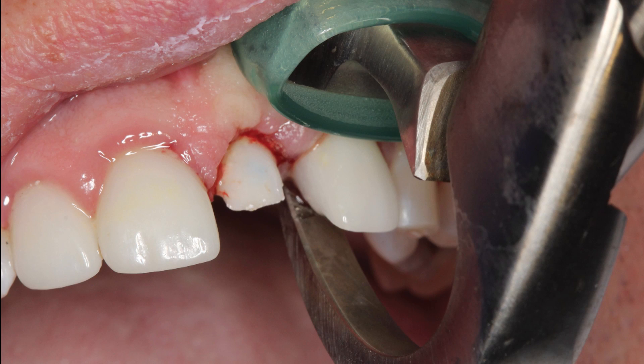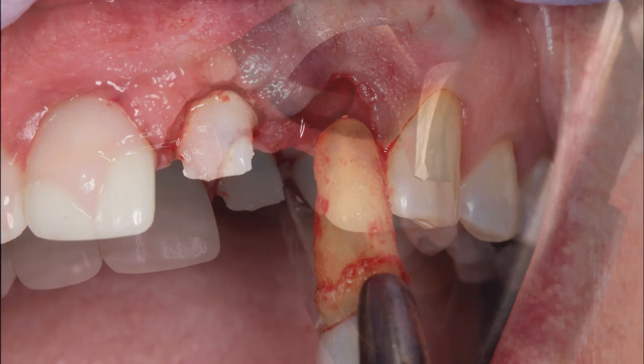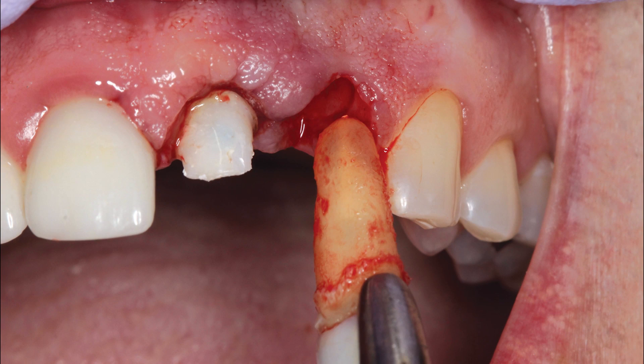To begin treatment, the non-restorable lateral incisor was atraumatically removed using the Golden Dental Solutions physics forceps. Removing the tooth in this manner maintained the facial plate of bone as well as the intercrestal bone that helps support the interdental papilla.